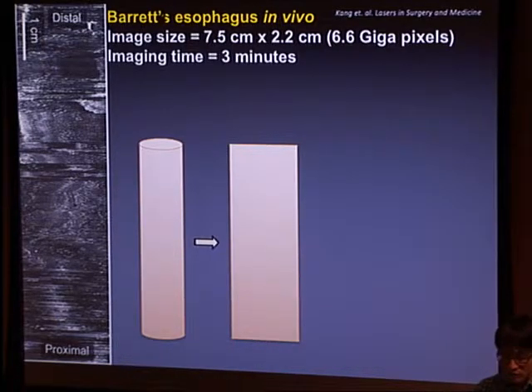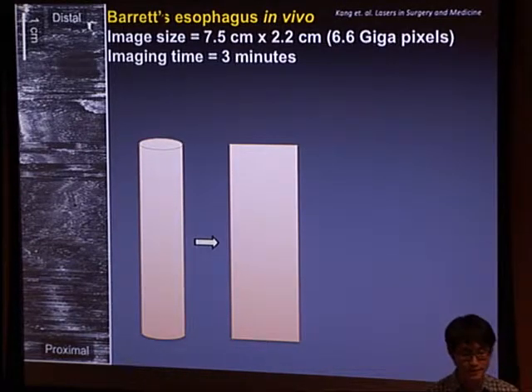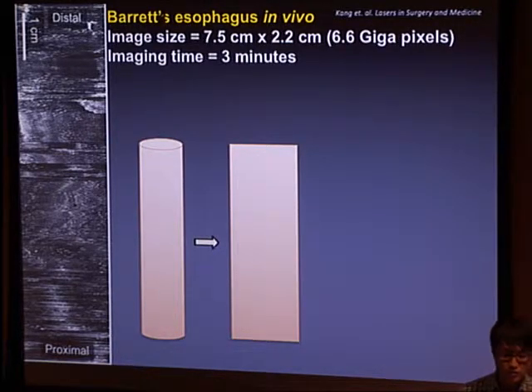So we can talk a little bit more about that. This doesn't have autofocus, and we carefully chose the tolerance between the rotating piece and the stationary piece in such a way that it has a dithering of a focal point, which is plus or minus 50 micron. So it still positions the focal plane inside of the epithelium where we want to look. But there was a challenge with that, and it's a little bit harder to implement, and that's something that we have to work on later. But for now it doesn't.